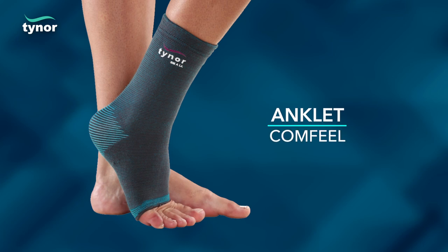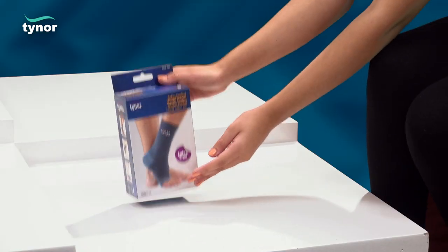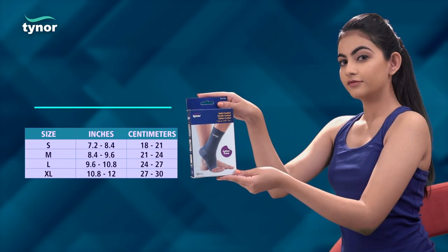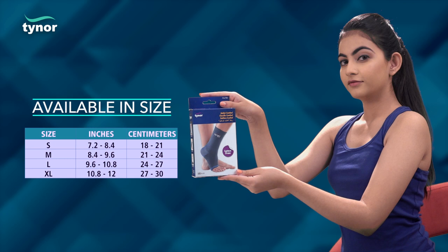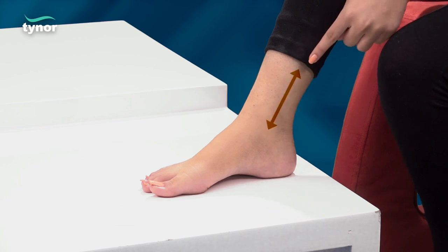Here we will discuss how to measure the size and how to wear the anklet comfile. The anklet comfile is available in four sizes. Measure circumference approximately two inches above the inner ankle joint.